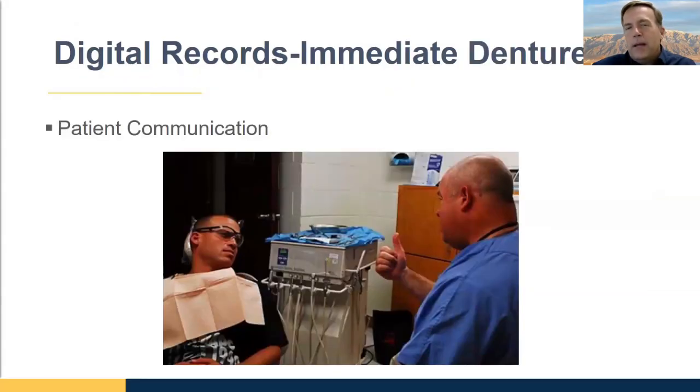So here I go beating on the patient communication again. You guys know this, but you've got to make sure you talk to your immediate denture patients. Most of the time, of course, their teeth aren't in really good shape, or else we wouldn't be extracting them all. But they're going to be going from the most stable scenario to the least stable scenario. They're going to go from having teeth to having a denture with a fit that is intrinsically unstable, because we can't predict exactly where they're going to wind up.